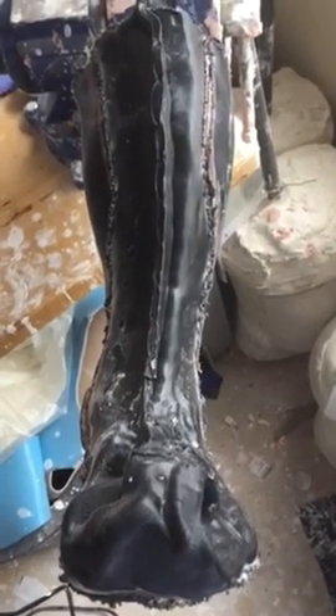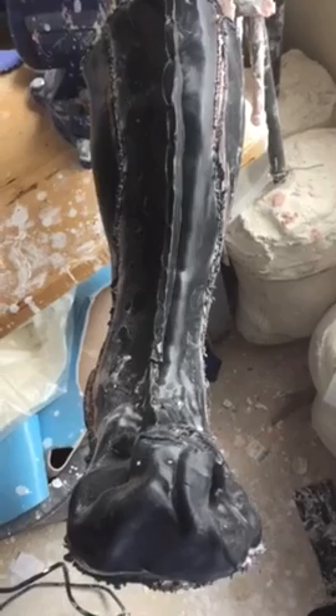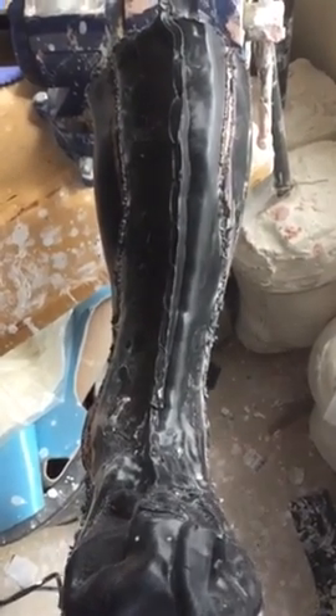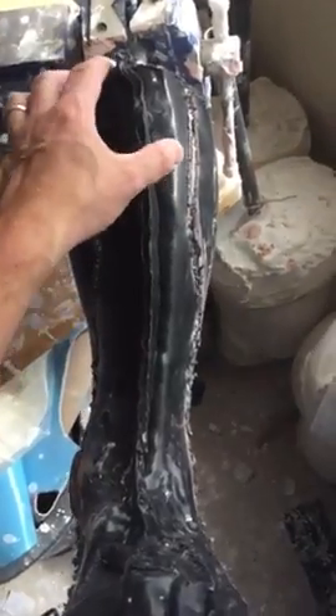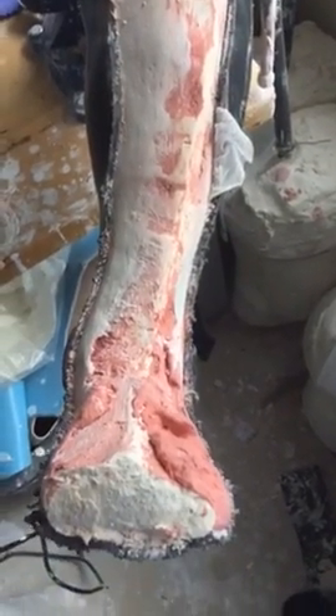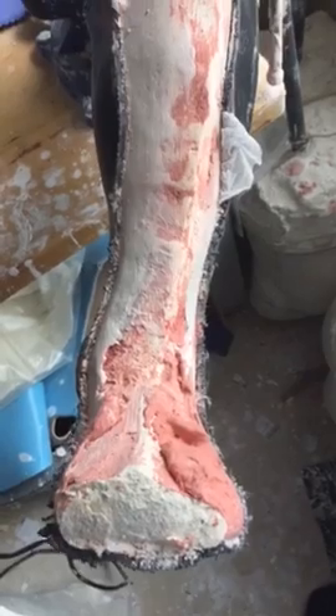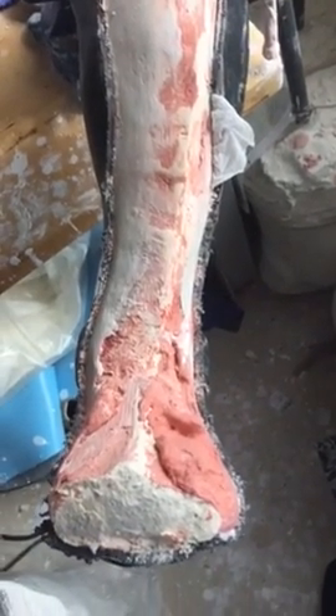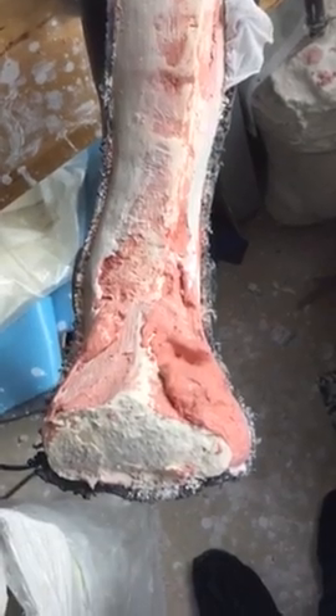This is the AFO that we're proceeding to cut off the cast. I'm going to take off the anterior shell that's not needed, and you can start to see behind the scenes what this is. The red on it is actually plaster of Paris that was added in the modification stages. I use a different color plaster so I can know what I added and what I did not.